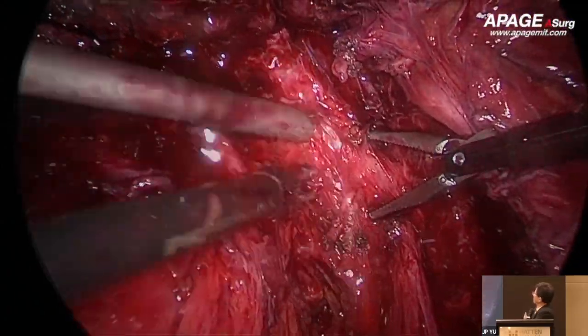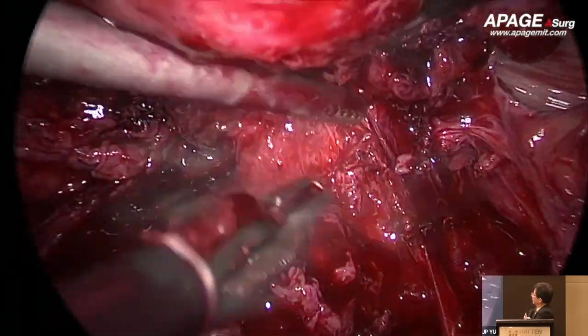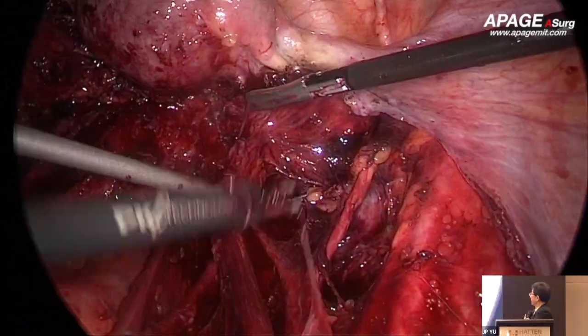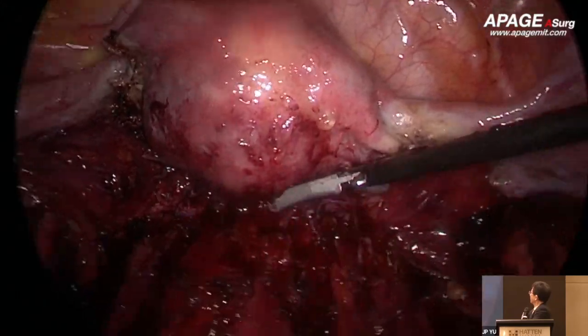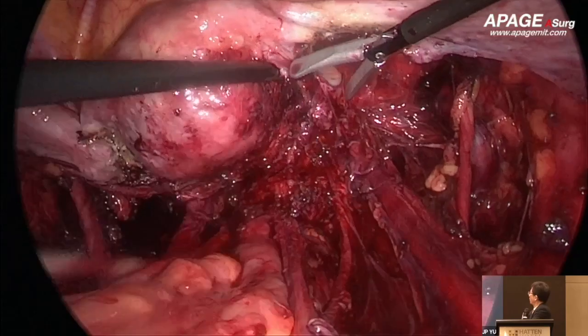Okay, so here very clearly they have up to the sidewall, and on the sidewall they still have some fibrosis here. Okay, so we identify the ICG again. We want to know if they have the same depth, the ICG positive node there, but it's still not. There are not any positive nodes on the pelvis. Okay, so here is the ureter clearly identified, left side ureter clearly identified.